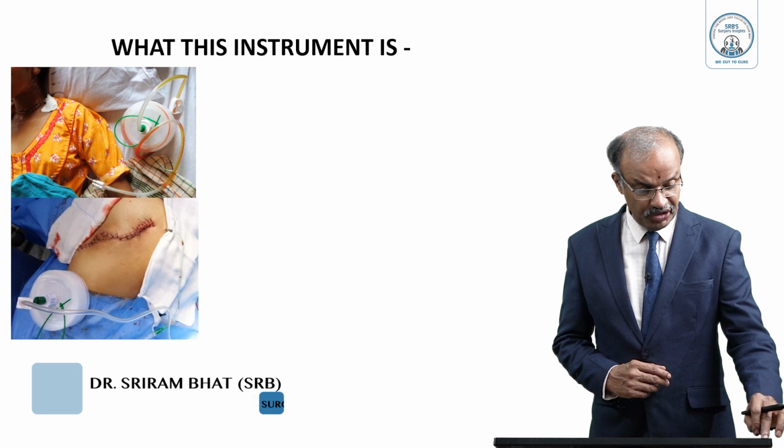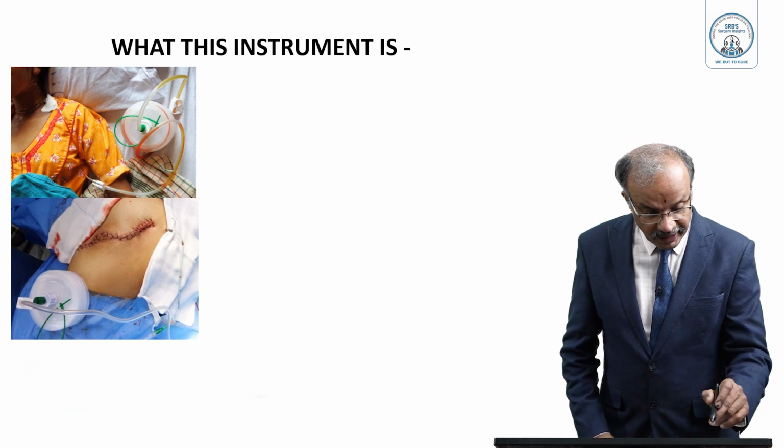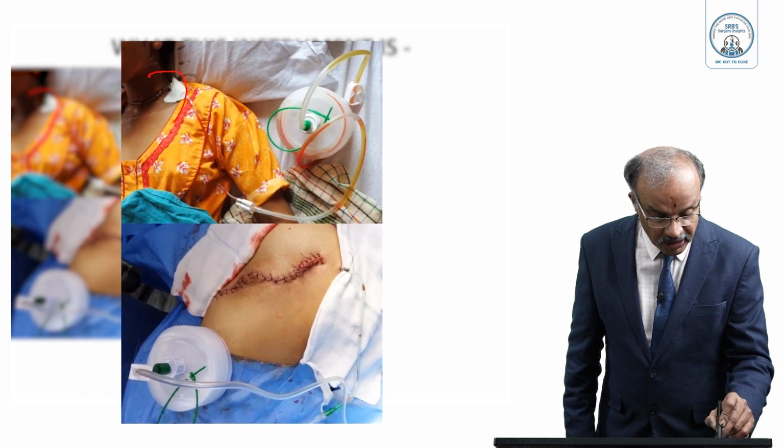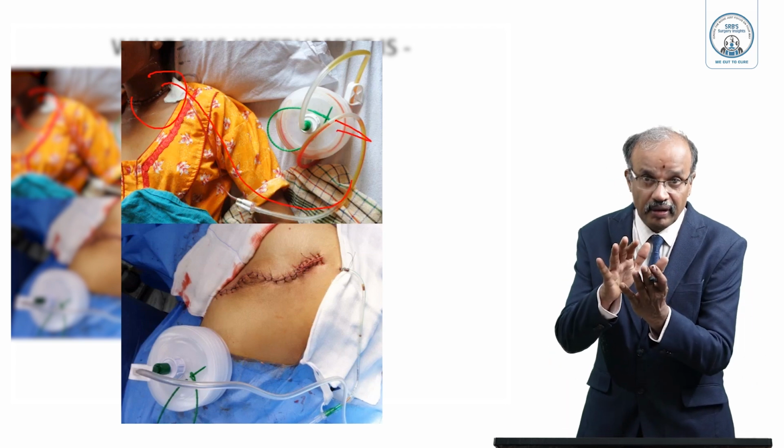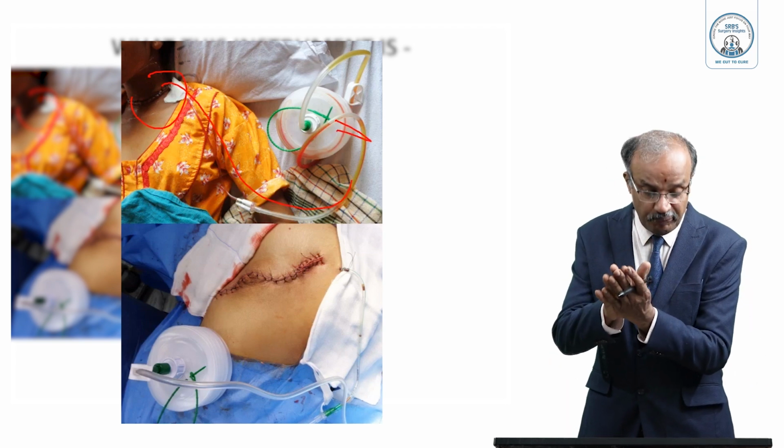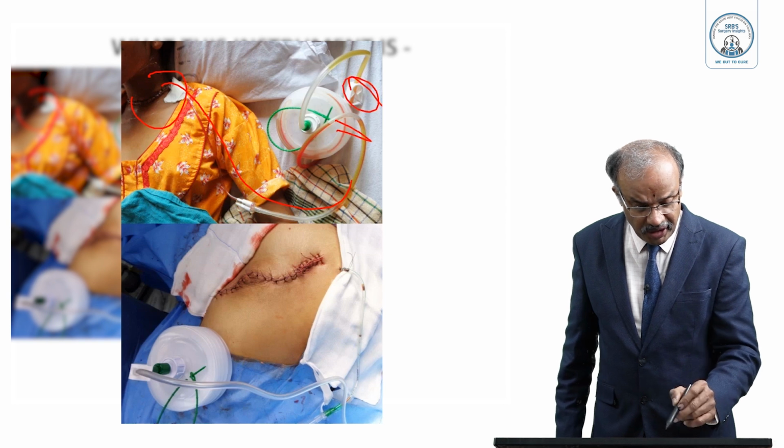Look at this, what is this instrument? Look at that. Probably a thyroidectomy is done here. Something comes here, and there is suction created by pressure. So there is a lock here.